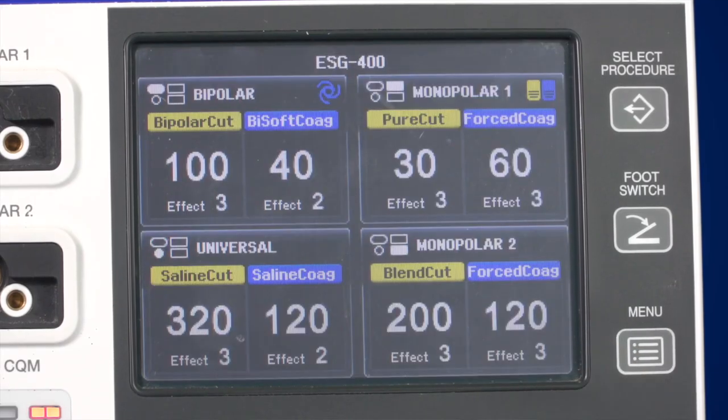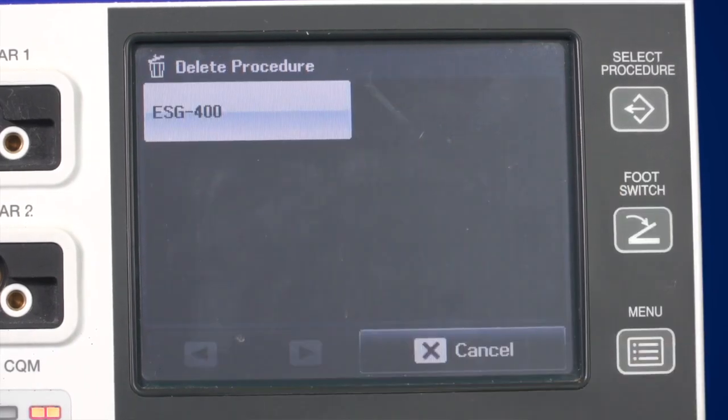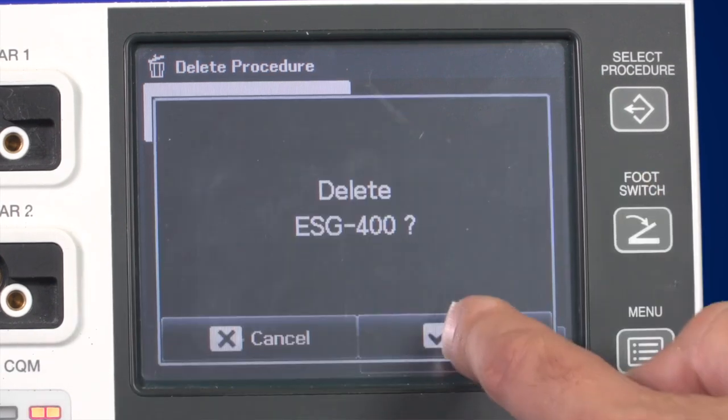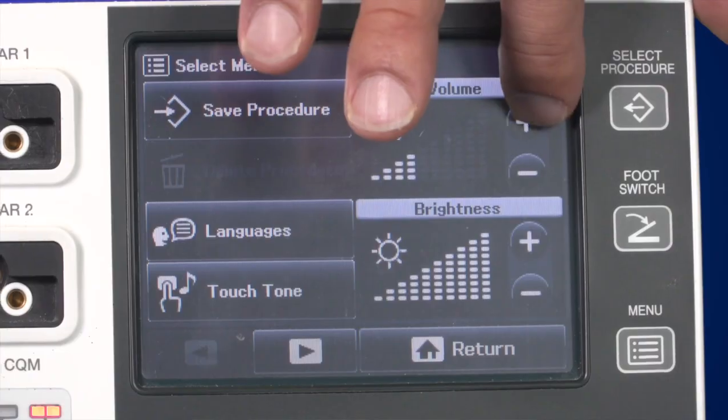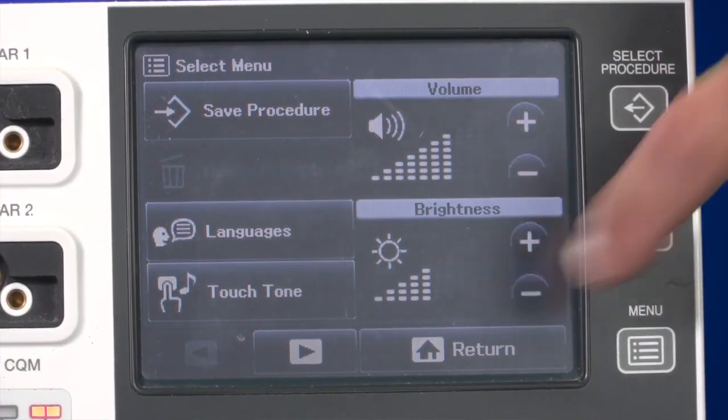If you want to delete a procedure, press the Delete Procedure button in the menu. After selecting the procedure, confirm that you really want to delete it. On the menu screen, you can also adjust the volume and brightness level depending on the surroundings and your personal preferences.